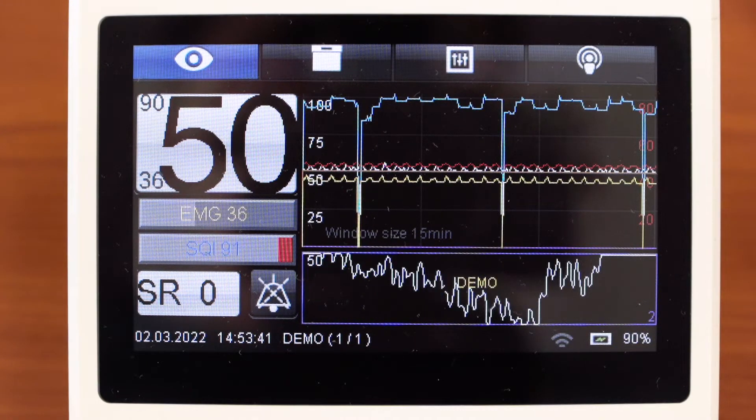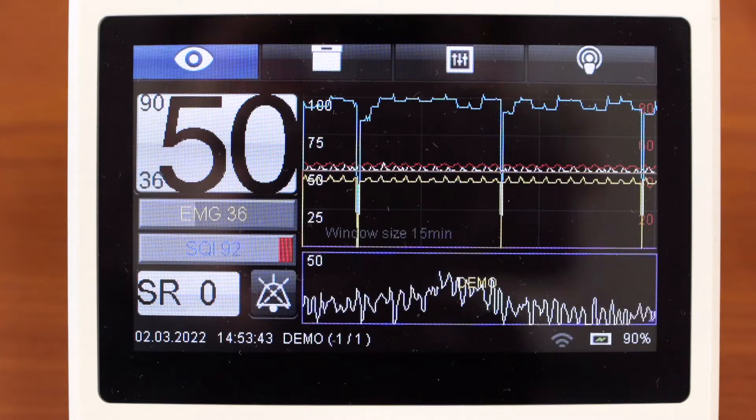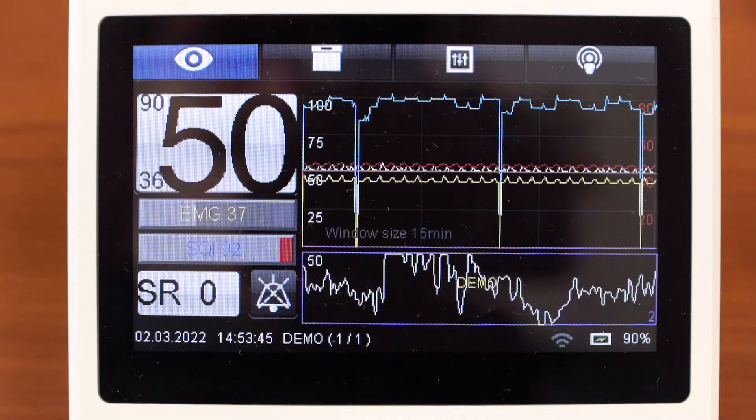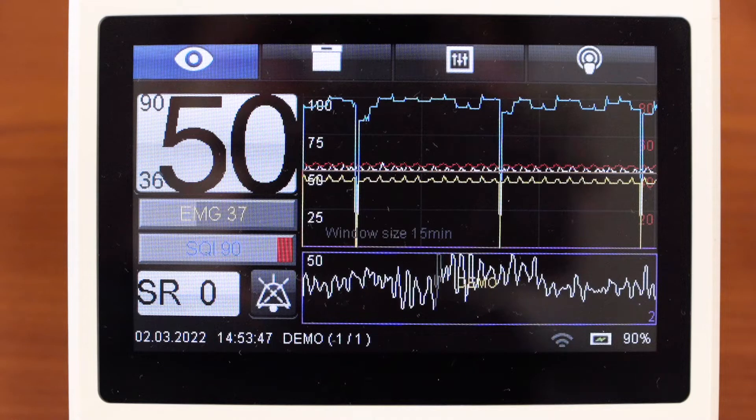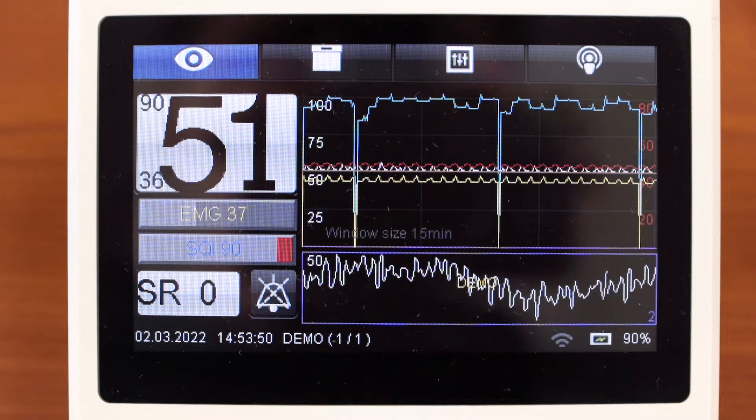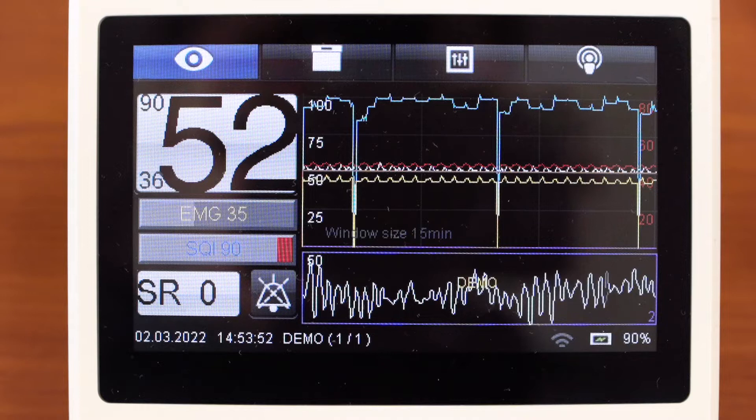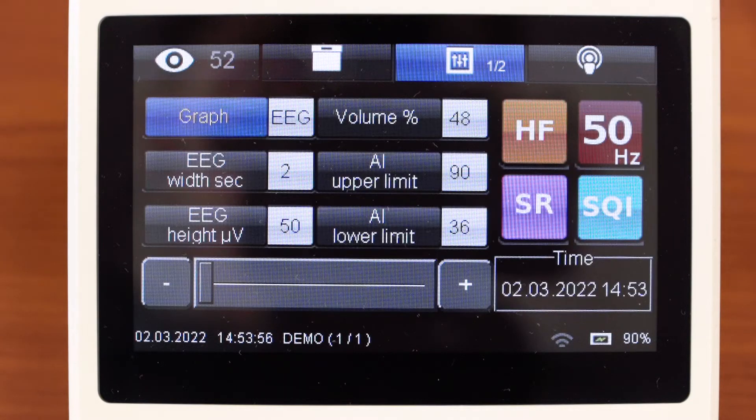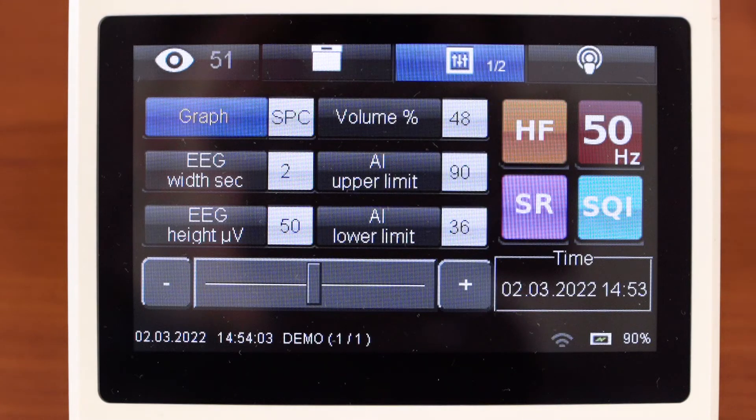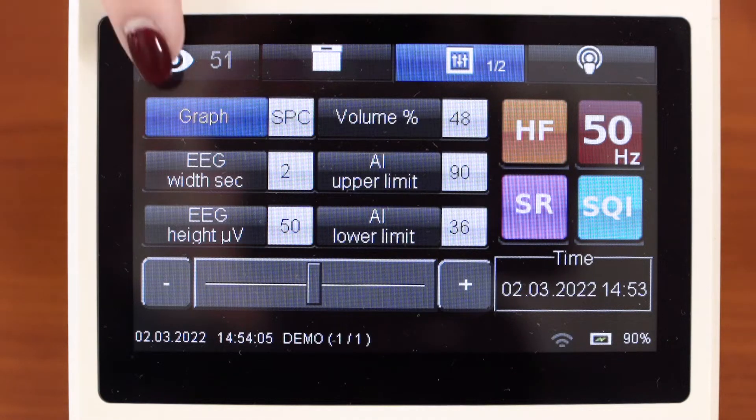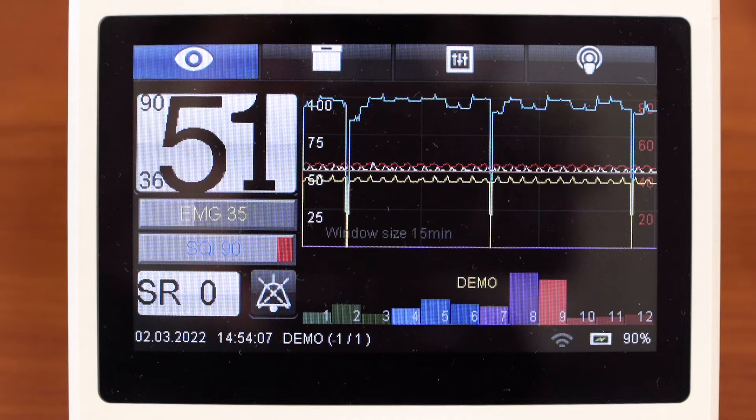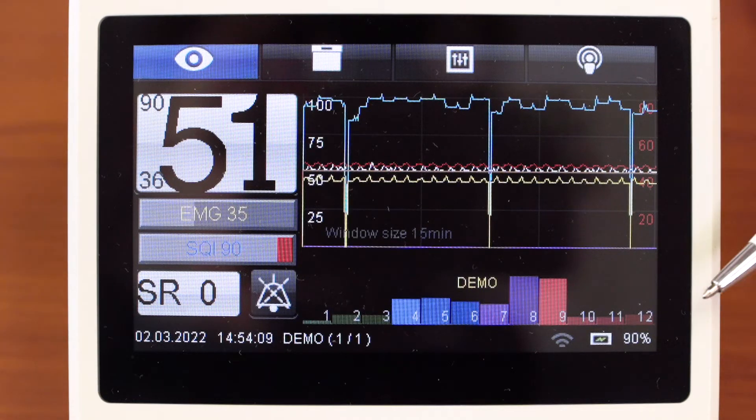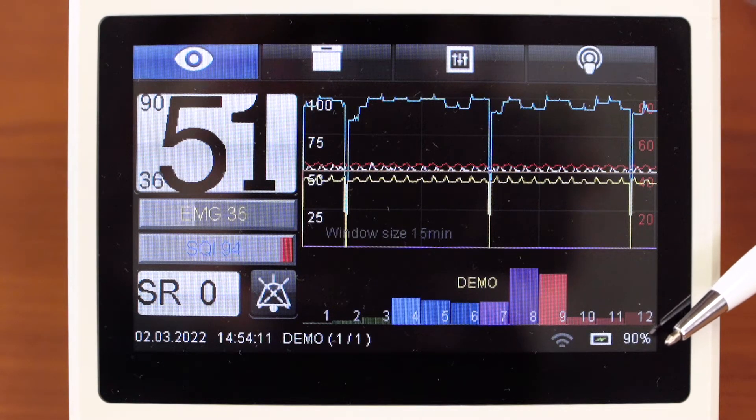Here is a field for EEG signal or EEG spectrum. The initial RAW EEG curves is complicated for the evaluation, but using the spectral analysis you can estimate the frequencies of EEG. You can choose the spectrum in settings window. Just press button graphs and plus. So you can display the spectrum and evaluate what frequencies prevail at the moment.